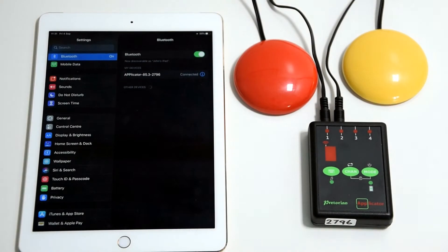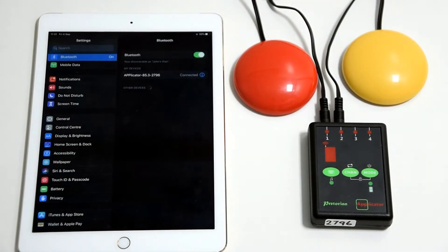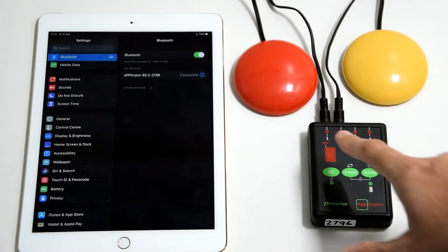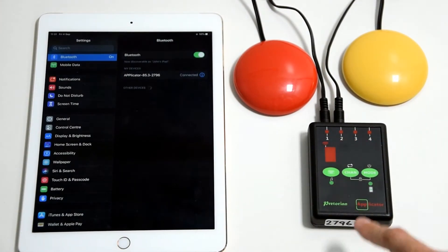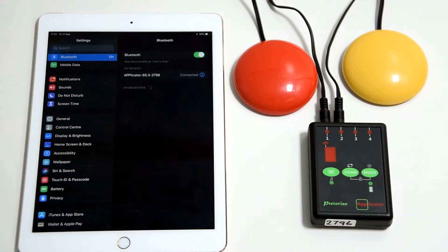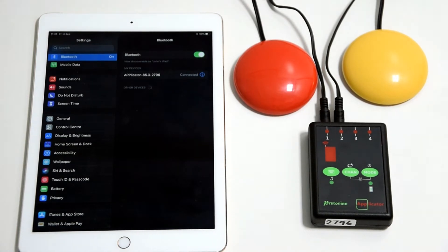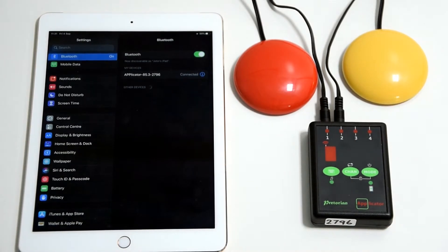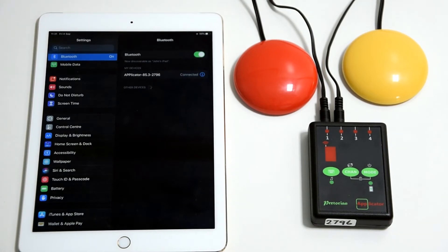Before we get started with setting up our switches, it's crucial that you have your switches plugged in and set to a mode that will work for your actions that you want to select. The applicator has a lot of different functions and quick access functions.